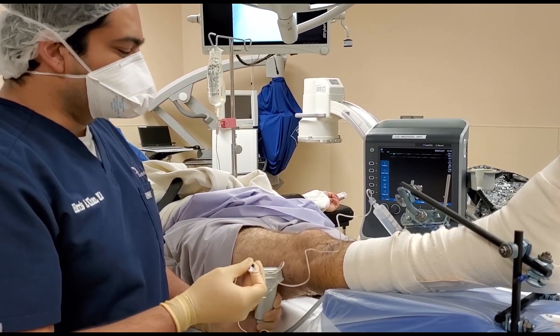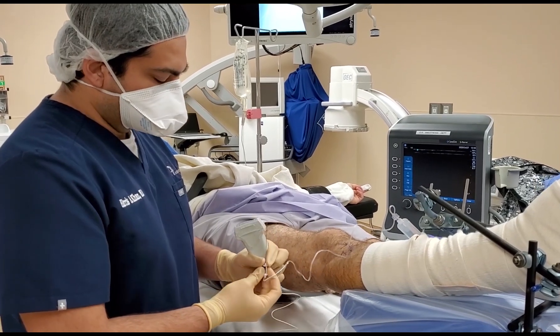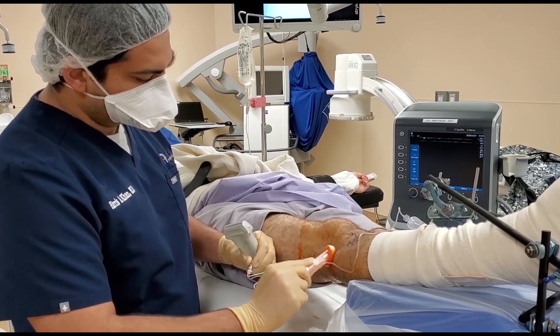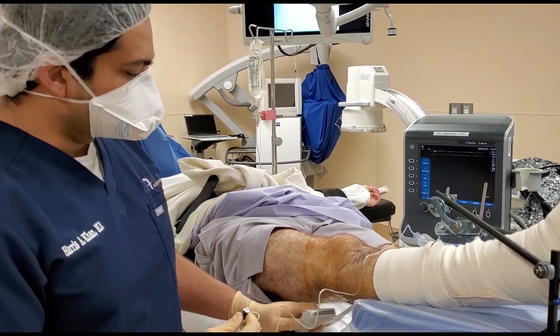There are a couple of ways to do this block, but this is the way I like to do it. Do kind of a semi-sterile technique, clean it with chloroprep, and then use a tegaderm on the transducer just to ensure a little bit more sterility.